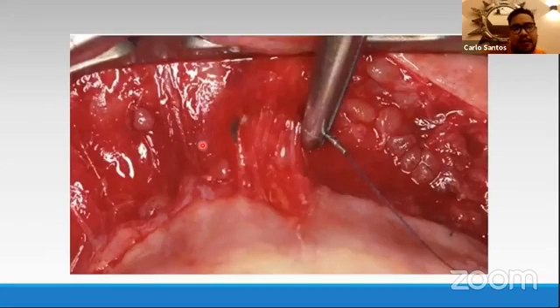So here you can see these are your minor salivary glands. It's perfectly normal, so that's okay if you see those. Here you can see the orbicularis oris muscle. You snatch it, and then what we do is like doing a ponytail. We bundle it, so it restricts its action. Imagine four people standing beside each other, lifting a board or a heavy bar. When they're standing equally beside each other, they can easily lift this. But if you bundle them, tie them, and restrict their movement and strength, it will take a toll for them to carry the bar. So again, you ponytail it.